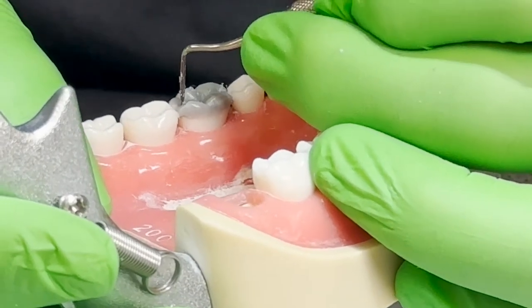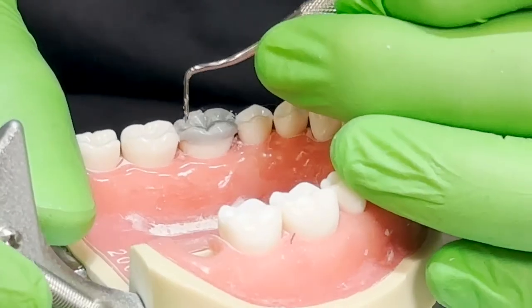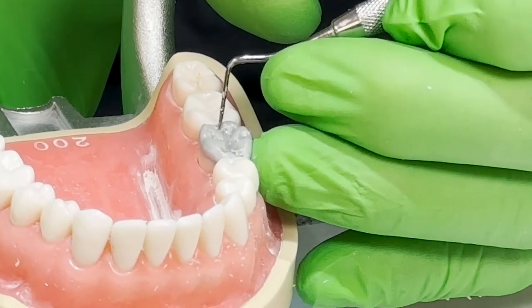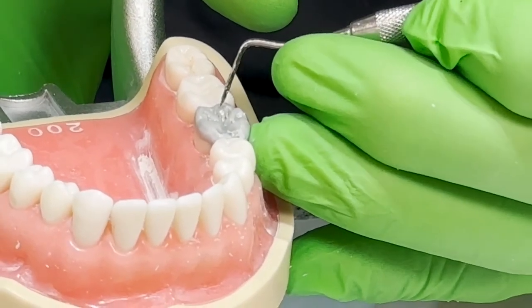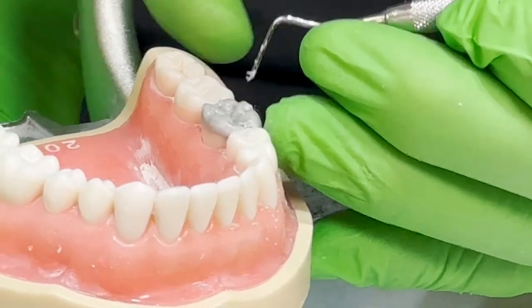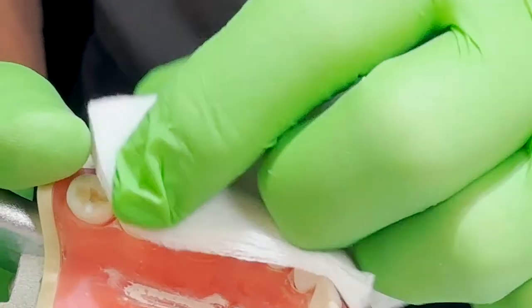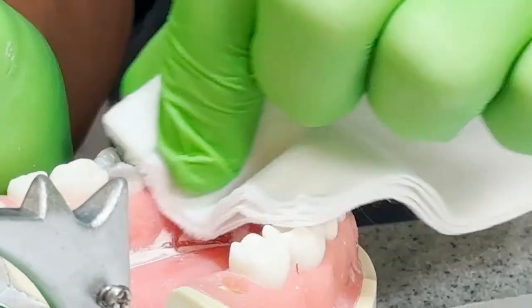With this color wax, you can use either red or green. Or blue, and it's going to show up. I think all of the waxes, you should be able to do that. I think some of the waxes are so dark red or a dark blue. But the ones we have are pretty light color. This is a great color for showing up. Yeah, it is.